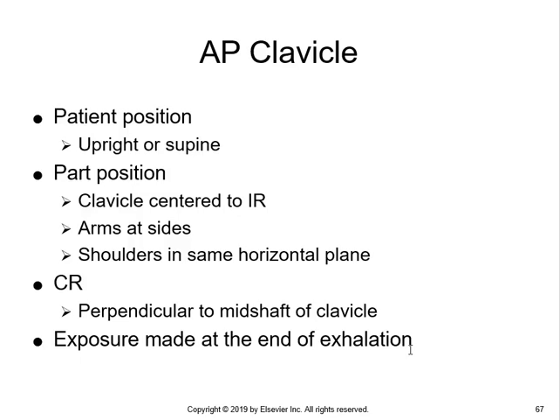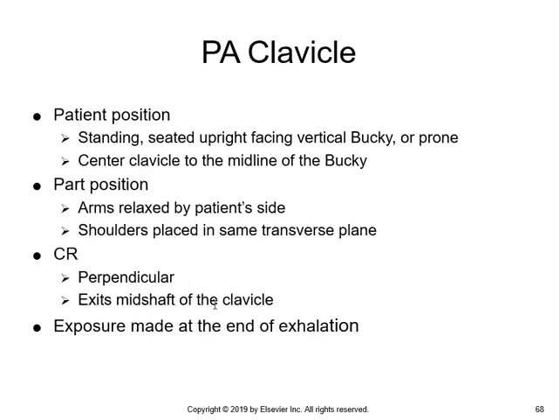And what that does is it compresses the lungs by virtue of not having the air in them. So it evens out the tissue density differences that would exist between the clavicle that's over the lung and the clavicle that's over the soft tissue. So that's AP. PA is just the reverse of that.